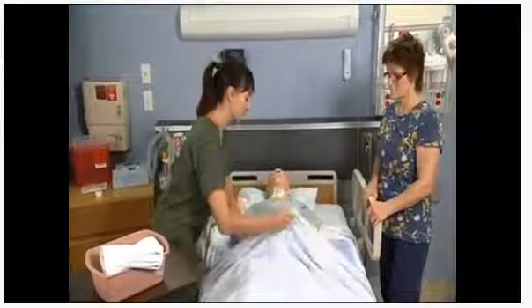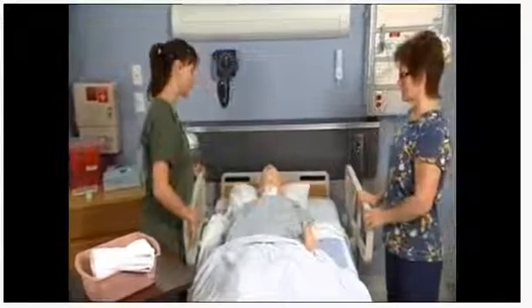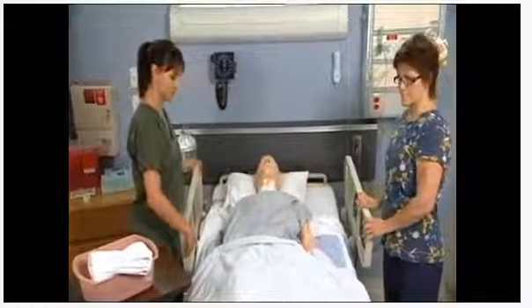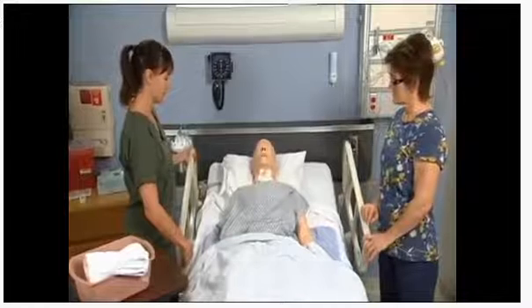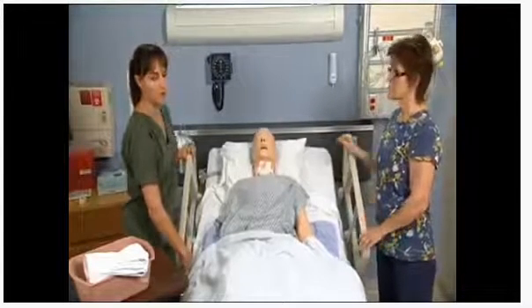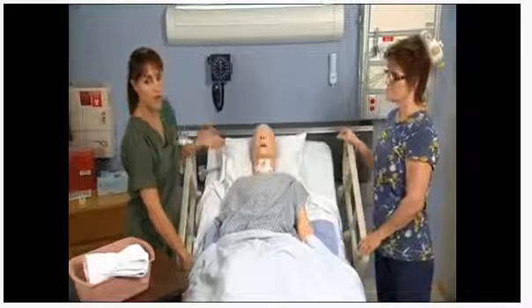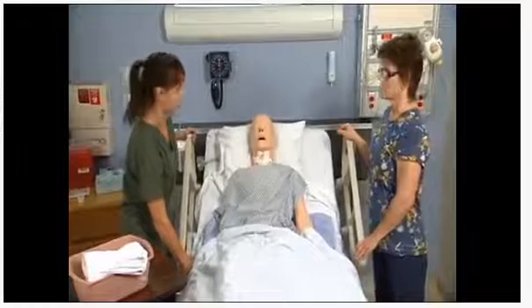Okay, Mrs. Jones, the very first thing that I'm going to do is I'm going to set you up, okay? And I need to set you all the way up into a 90-degree angle. Now, during my planning phase, I made sure that I planned for assistance, which I have. Also, I plan for any kind of equipment, and I will go over each equipment pieces with you.